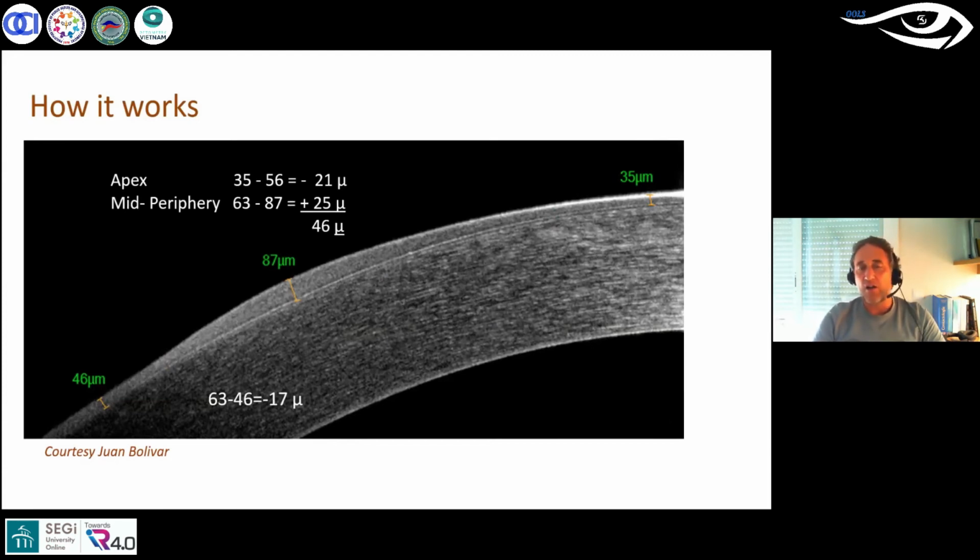These changes are what we are calling a refractive technique, that is additive in material here, and subtractive in material in the center. So it's both that changes the total thickness, and we are creating the new shape.